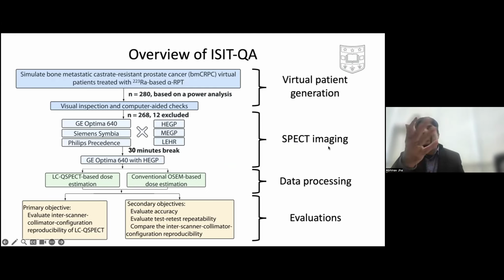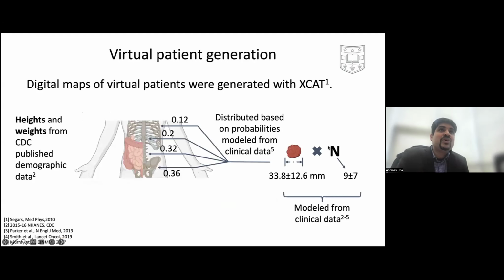So we had these 12 lesions, or 12 patients, whom we excluded. What I'm speaking about is basically sampling. I want to use the word artifact, but when you sample from a Gaussian distribution, you inherently get values that are low. And this is like a patient who's coming in who has such a small lesion that they would not qualify or not be eligible for this trial. So again, you define eligibility criteria, you sample a lesion size, and sorry, you can't be recruited. But that's a virtual patient, so they would not mind.